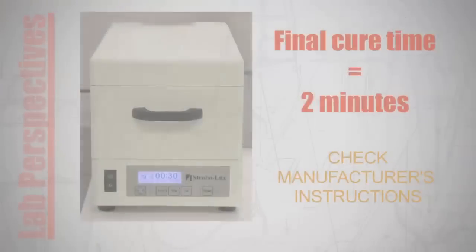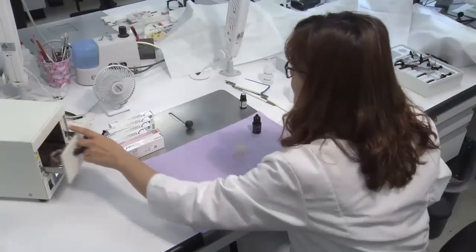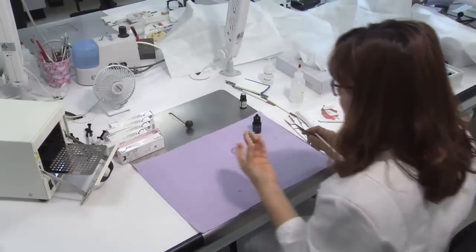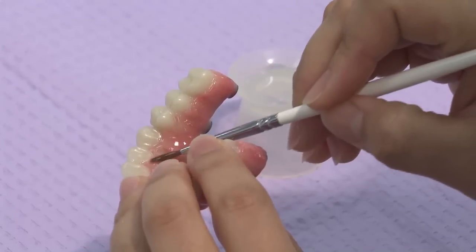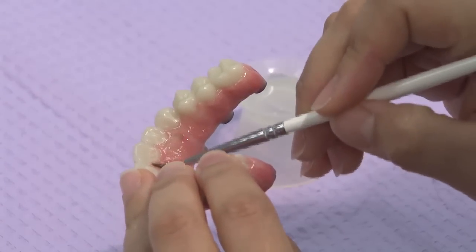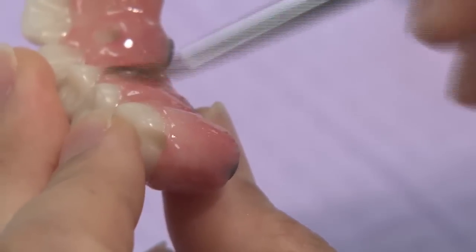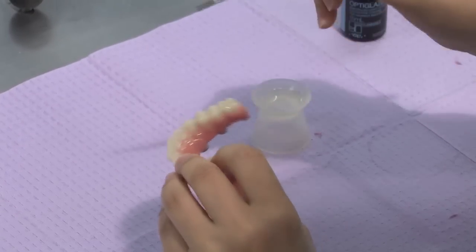At Glidewell Laboratories, the final curing time is 2 minutes, but check your manufacturer's instructions for your specific timing. To achieve a high-quality device, all bubbles and misplaced brush strokes should be eliminated prior to curing. Don't expect things to disappear during the cure cycle. If you can make the appliance perfect at each step throughout the process, the end result will also be perfect, all in about 30 minutes or less.